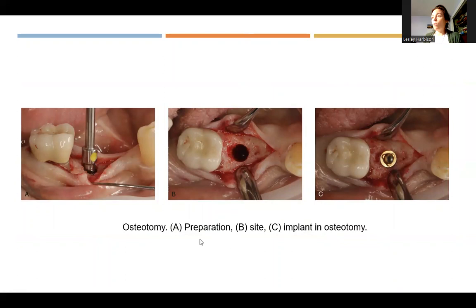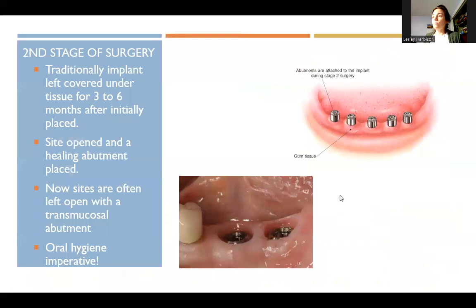This shows making the initial surgical incision into the bone, prepping it, and then placing the implant.